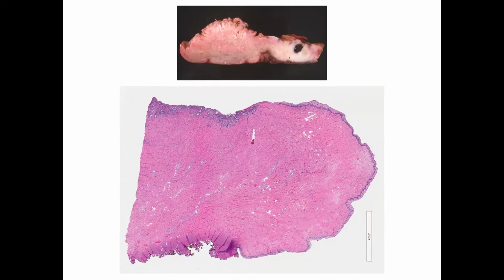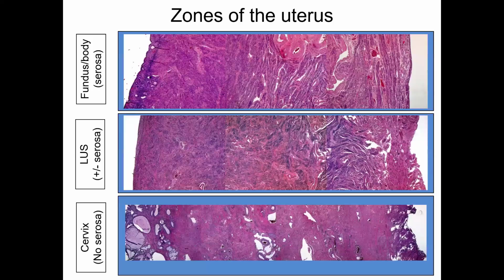Those of you who signed out with me will know that when I put this section under the microscope, this is the first area I look at, just to make sure that the surgical margin is negative, irrespective of what I'm going to find in the cervix itself. This part needs to be carefully examined because it is the surgical margin of the cervix.